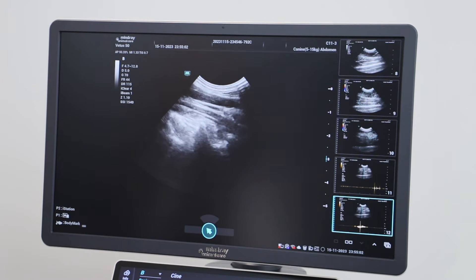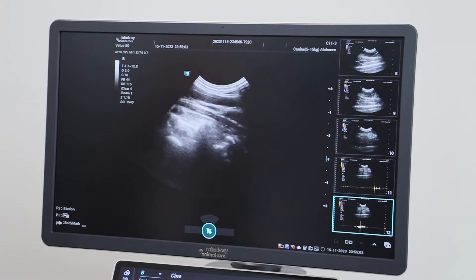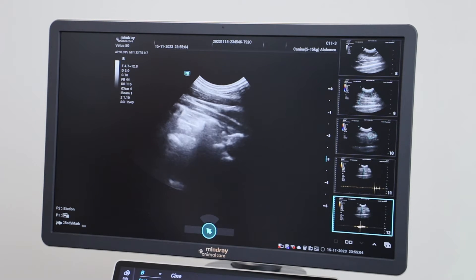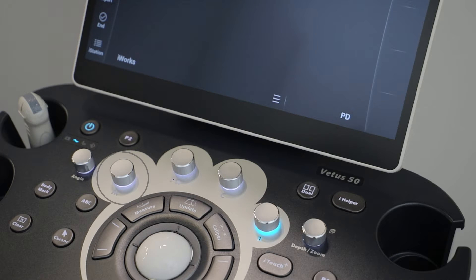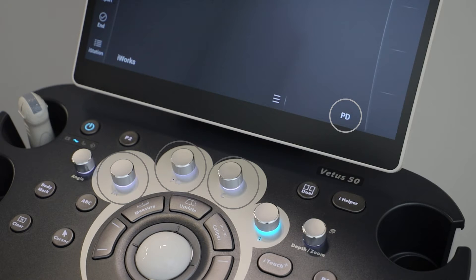Until now we have been using the B mode functions of the scanner, however it does also have a number of other modes. This includes M mode, pulse wave Doppler, color Doppler, and power Doppler.